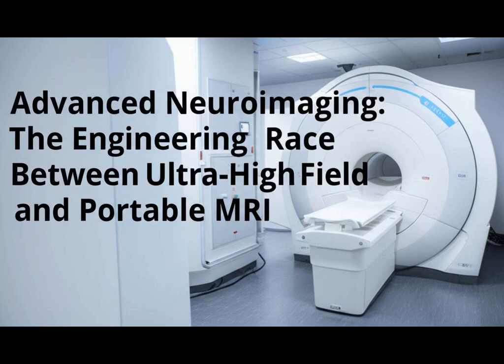The big win? Accessibility. Portable units can be wheeled to a patient's bedside in the ICU or emergency room, used in mobile stroke units, or deployed in remote clinics or developing countries lacking conventional MRI. Systems like the Hyperfine Swoop even run on a standard wall outlet. This allows faster diagnosis for critical conditions like stroke or head injury, especially for patients too unstable to move. The lower fields also pose fewer safety concerns with implants.